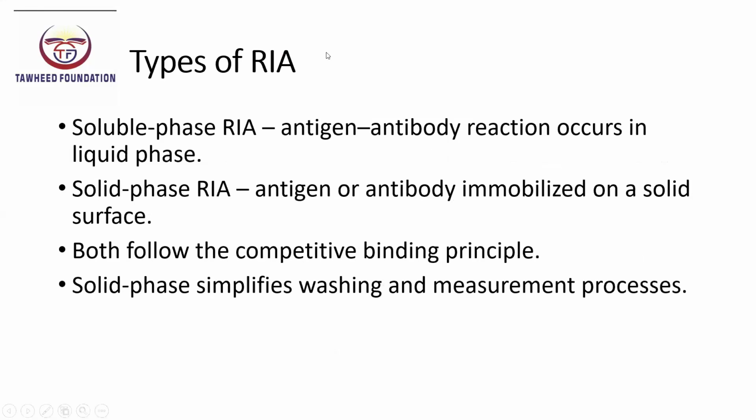Next is types of RIA. There are two main types of RIA based on the phase in which the antigen-antibody interaction occurs. First is soluble phase RIA. Second is solid phase RIA.